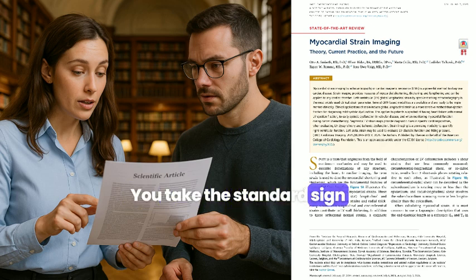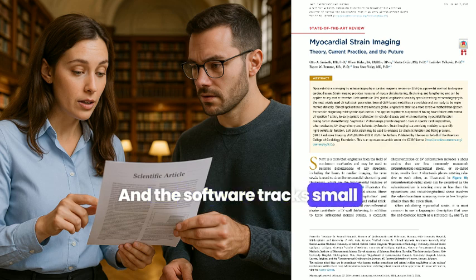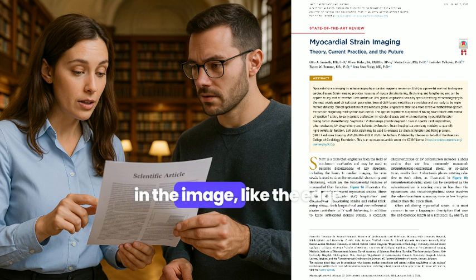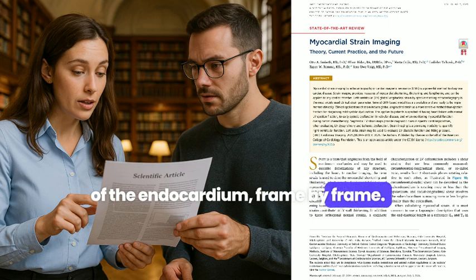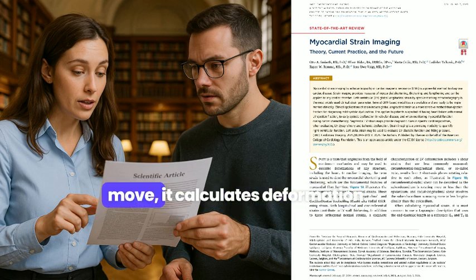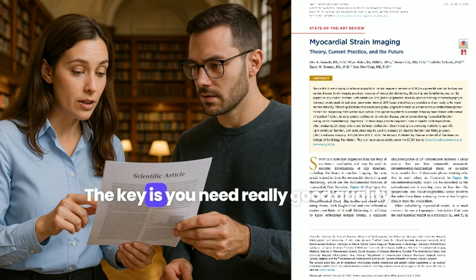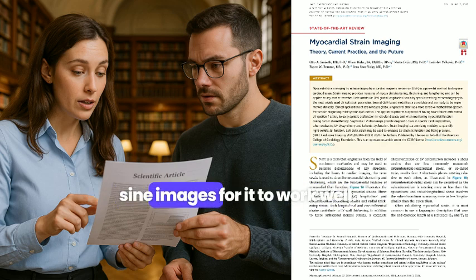You take the standard cine images, the moving pictures of the heart we get routinely. But the ones we always look at. Exactly. And the software tracks small, naturally occurring features in the image, like the edge of the endocardium frame by frame. So it follows bits of the image itself. Yep. And from how those features move, it calculates deformation. If you know the frame rate, you get velocity and strain rate too. The key is you need really good quality cine images for it to work well.